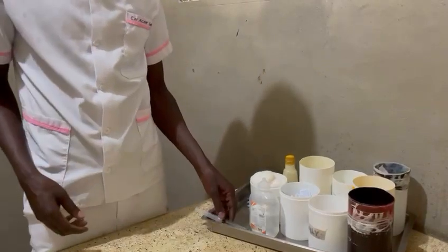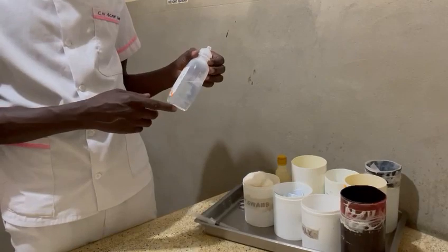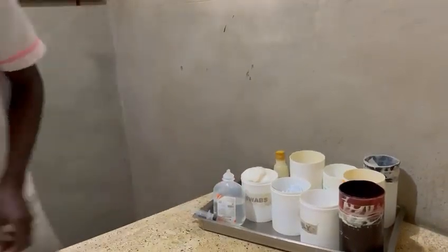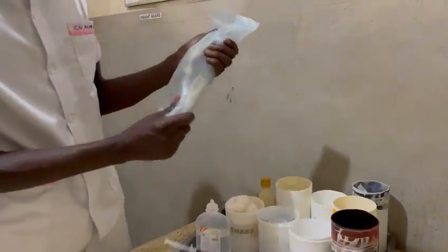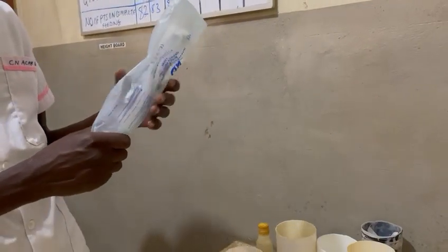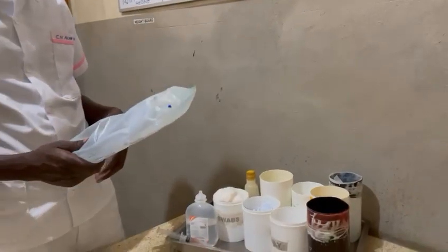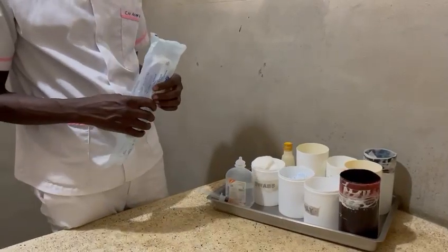Now, if they have prescribed 100 milligrams, I'm going to aspirate only 3.3 mils from here. I put the dextrose up to here and then aspirate the 3.3 mils and place it here to make 100 mils.